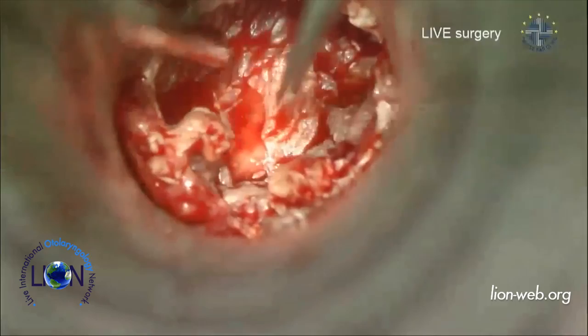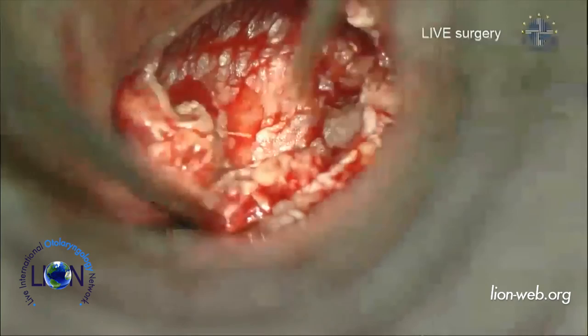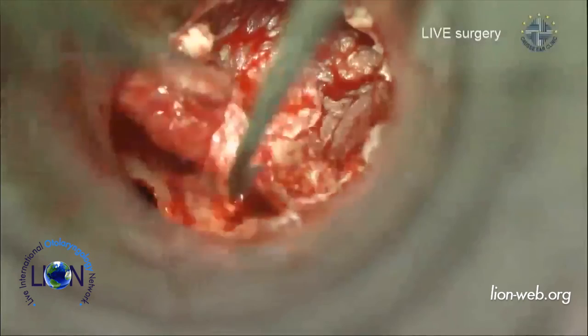It's really quite malleable, isn't it? Yeah, it is completely malleable. I never realized titanium was that malleable. So this is now fine, I think. Maybe a little bit more, and maybe a little bit more like this. Yeah, I like it now like this. That's fine. Okay, now we need to measure the distance from the stapes foot plate to the malleus handle.